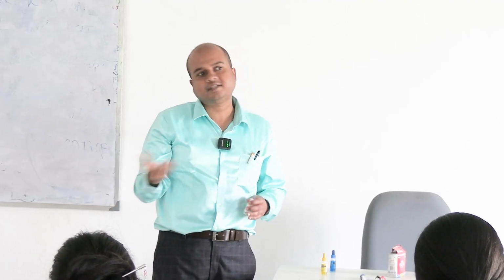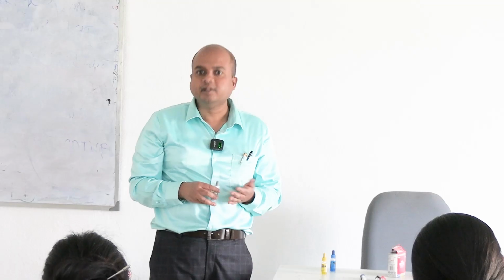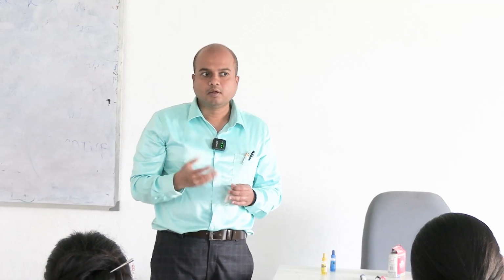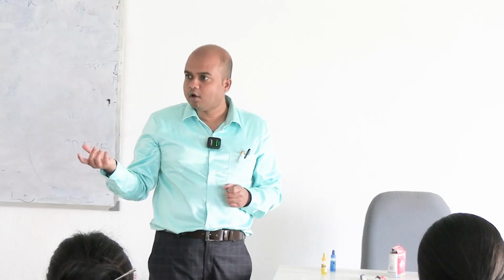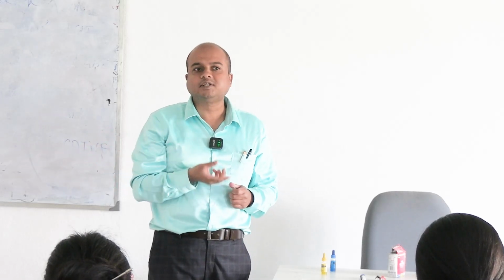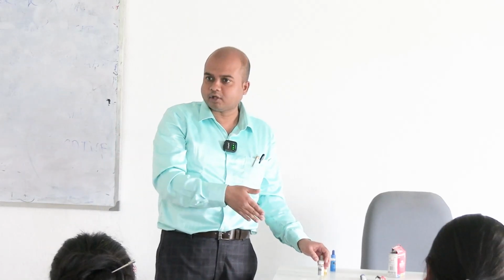Now the results are simple. If agglutination occurs in all 3, then the blood contains A, B and D antigens, so the blood group is concluded as AB positive. If it occurs in the A and D parts but not the B part, the blood group is A positive.